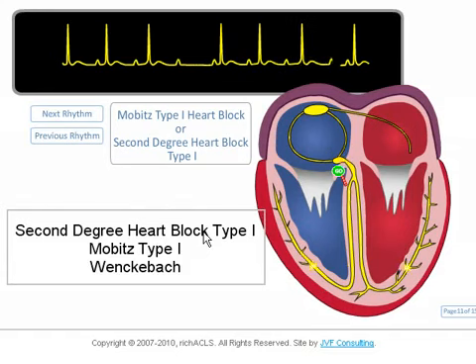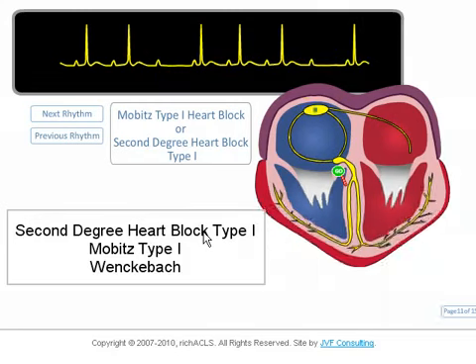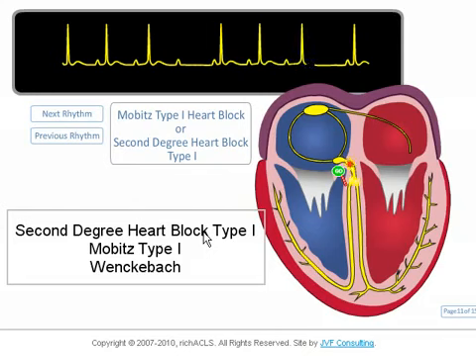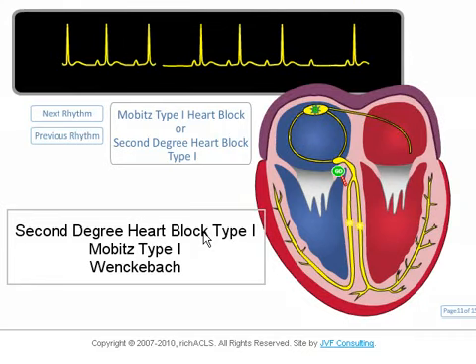An analogous situation, although a bit of a stretch, might be an 8 to 5 Monday through Friday worker. Monday the worker is fresh, Wednesday he's tired and can't do much work, Friday the worker is so tired he cannot do his job and has to go home, Monday he's fresh again and is able to do work.